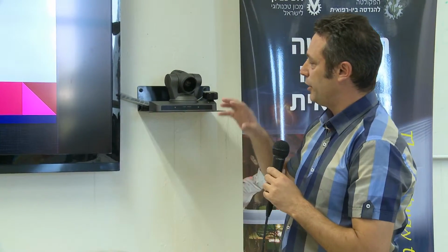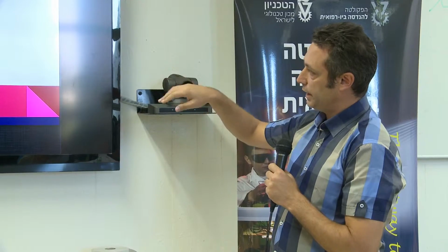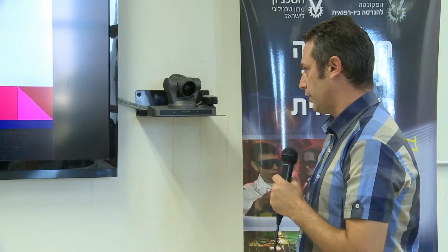So in a bird's eye view of the system, the idea is we have sensors going up to the cloud, getting analyzed, producing alerts, and producing Watson recommendations that can go back to control devices that are connected to the patient, like a CPAP or oxygen concentrator.